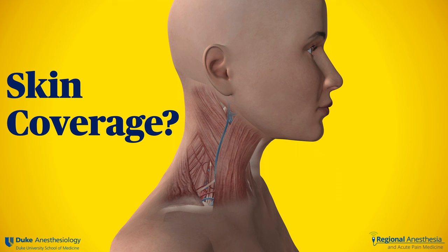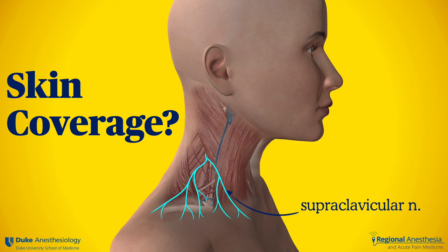The clavipectoral fascial plane block is not designed to get skin coverage, since the local is sequestered within the tubular fascia. However, we've noticed that sometimes we do end up getting the skin overlying the clavicle and upper chest wall — i.e., the supraclavicular nerves. It may be that some local escapes the sheath due to the fracture or needle puncture, or perhaps some of the skin fibers traverse that fascial compartment. In any case, to be complete, it's quite easy to do a supplemental subcutaneous injection just above the clavicle to numb that area.